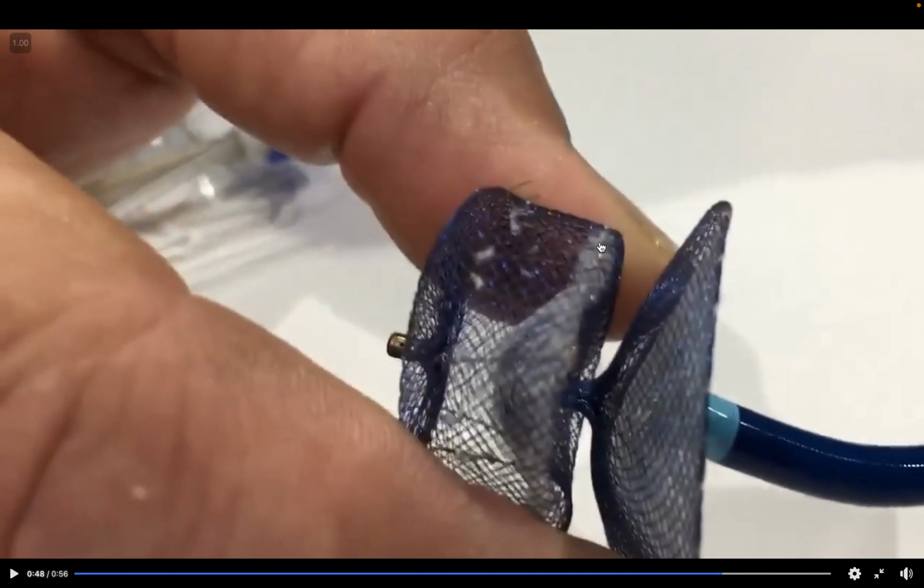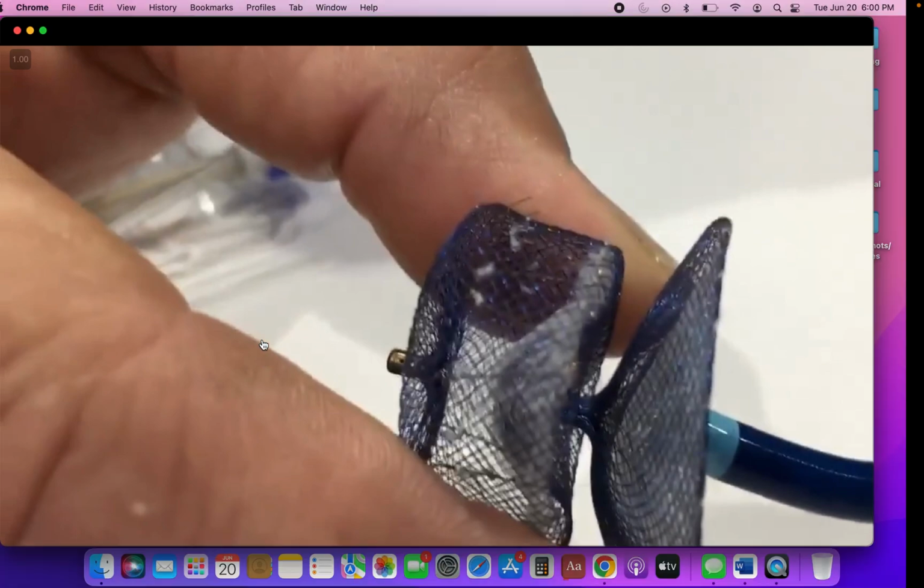So you can see that the gentleman's fingers can represent compression of the neck of the left atrial appendage. If he compresses this too small, there could be erosion, especially considering these wires are going to potentially penetrate and potentially compress and erode the structure. But if it's not compressed enough, you could have an embolization risk, which happened in this patient.